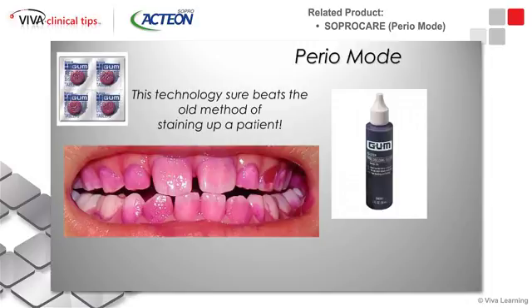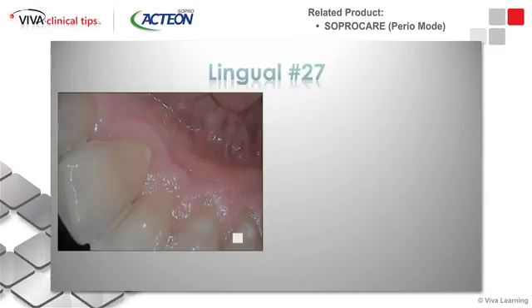Now, it sure beats, and anyway, I guess I'm dating myself, but when I went to hygiene school, the only way we could instruct the patients on where the plaque deposits were was by using the red coat disclosing tablets or the dye. And nobody likes this. If you're a hygienist, you don't like to use it. If you're a patient, you don't like to have it used on you. So no need for that anymore. It kind of just throws that right out the window now, because we can actually educate our patients just by using this technology. Let me just show you some examples.